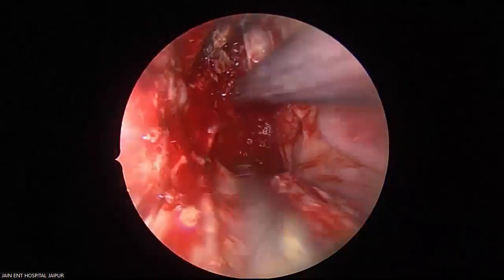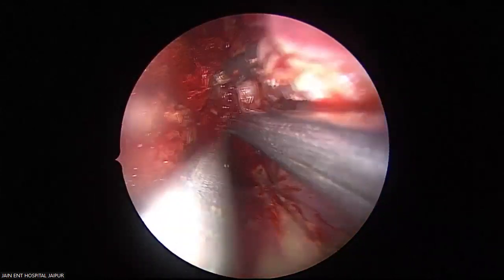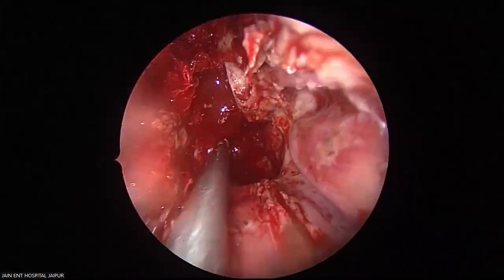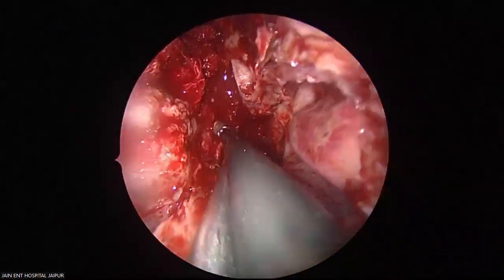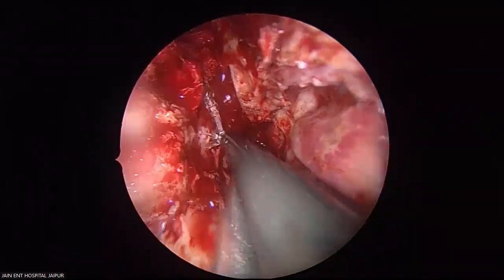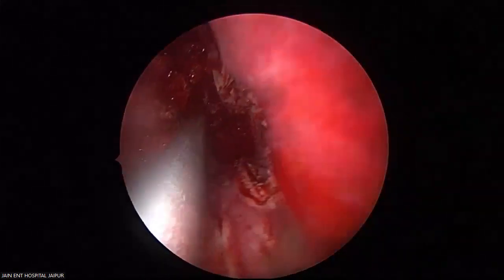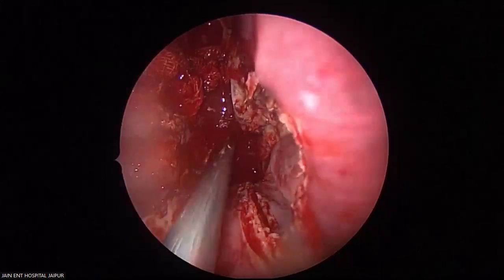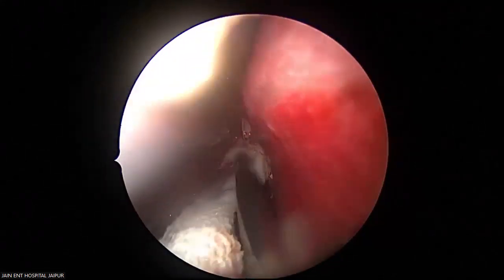Section. See the nasopharynx very clear? Yeah. Some of the vessels here at the pterygoid zone you can see. This pterygoid bleeding is one thing you must understand, see the bleeding coming from the pterygoid bone. This is difficult to control like this because it is mostly venous, and we'll remove this pterygoid process later.